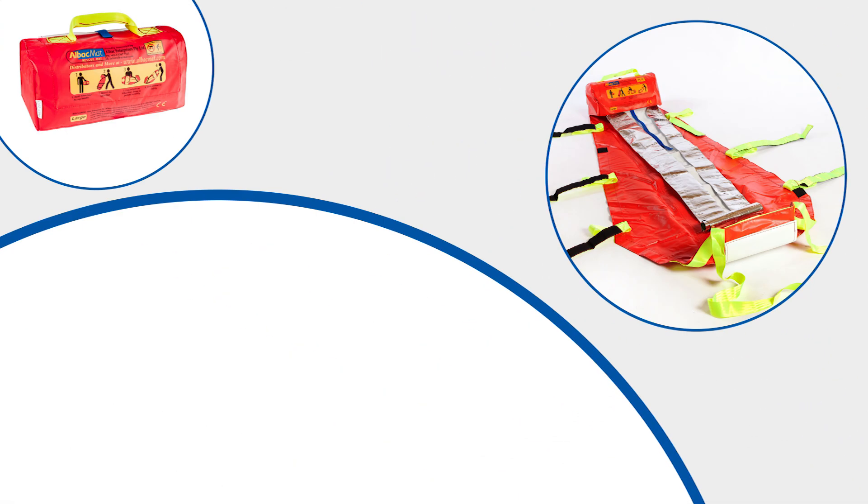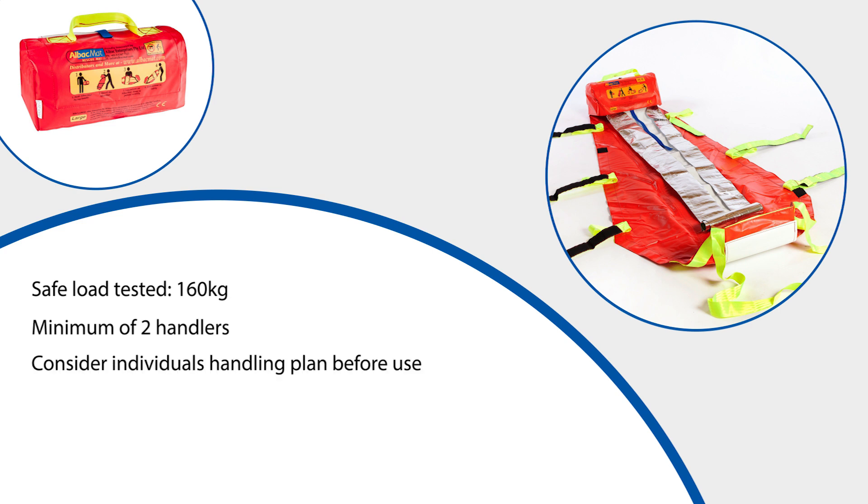The ALBAC mat has been safety tested to a maximum weight of 160 kilograms, although the maximum load to be pulled should be advised by your manual handling advisors. It is recommended that a minimum of two people handle the ALBAC mat. As a general rule, the maximum weight being pulled should not be more than that of the combined handlers. Each user will have his or her own handling plan and this should be considered before transferring any user using this equipment.